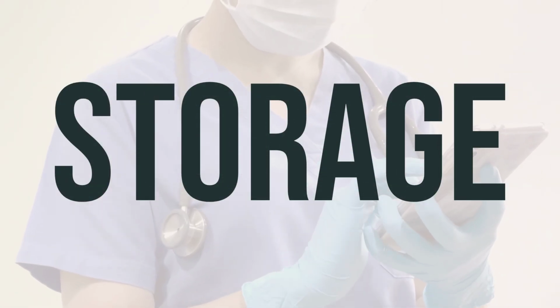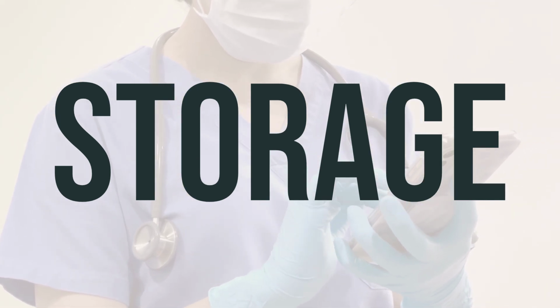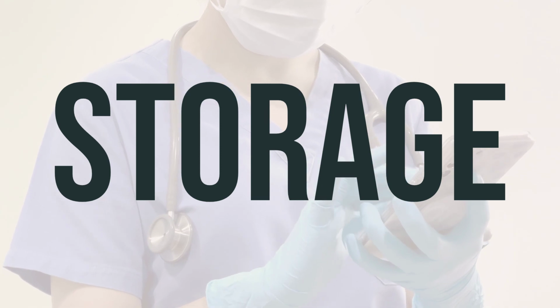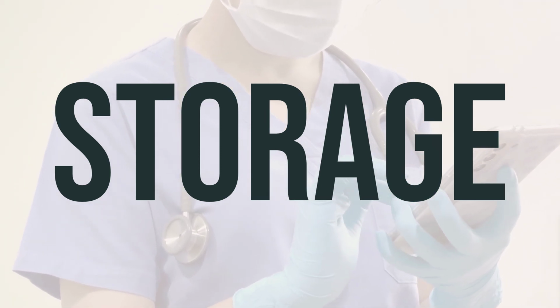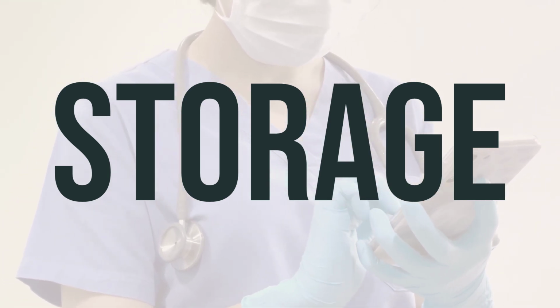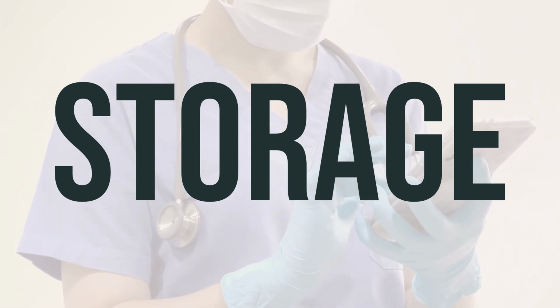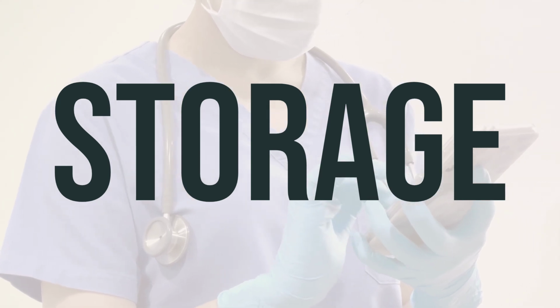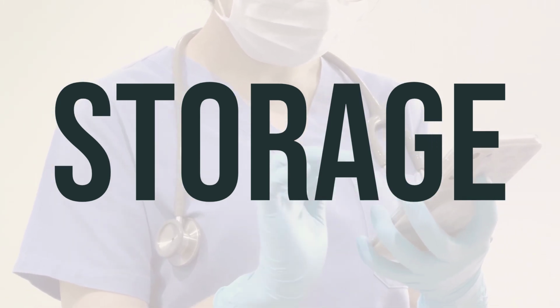When using Paragard T380A 380 square mm intrauterine devices, IUDs, it's important to store them at room temperature. Keep them away from children and pets to prevent any accidental ingestion. When it comes to disposing of the product, do not flush it down the toilet or pour it into a drain unless specifically instructed to do so. Instead, properly discard the product when it is expired or no longer needed. You can consult your pharmacist or local waste disposal company for the best way to dispose of it.